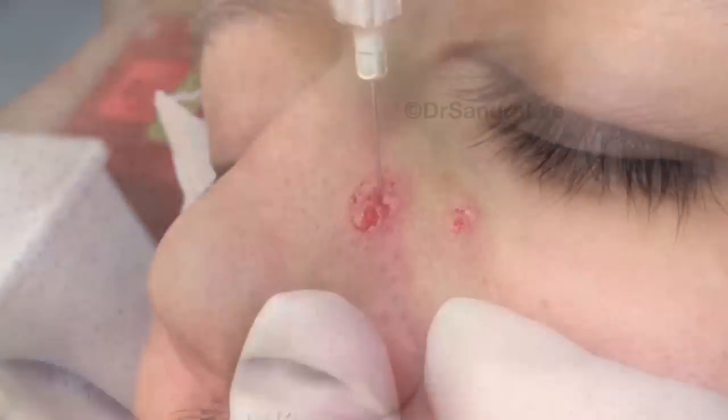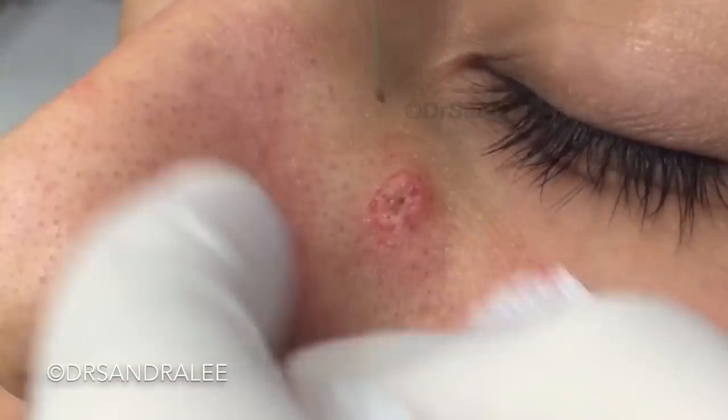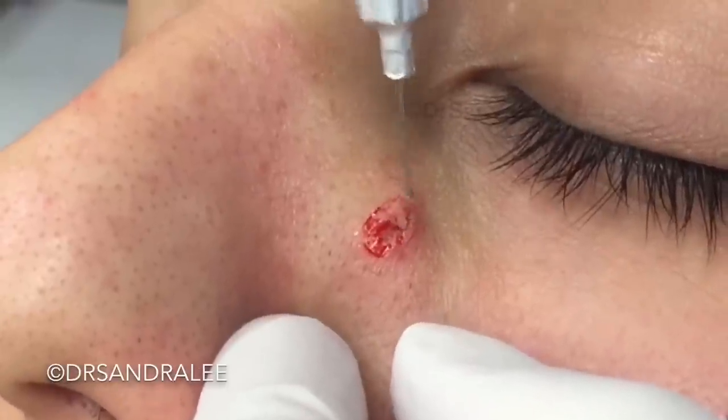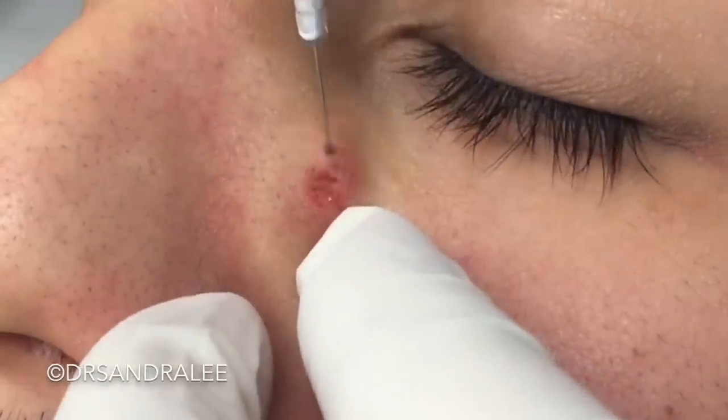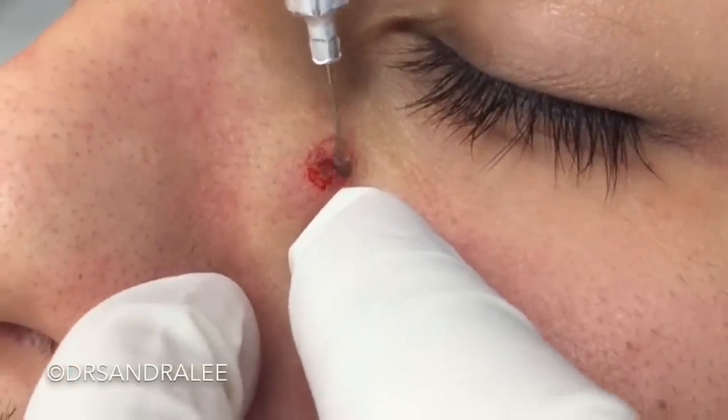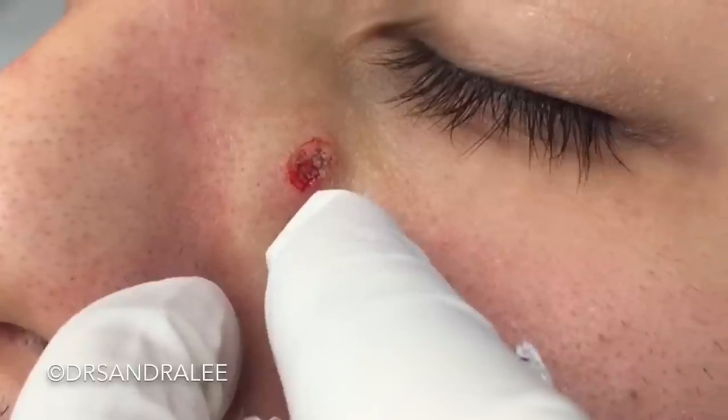There we go. It helps to kind of sculpt the edges a little bit. If I turn it on at a low setting, it kind of helps to get rid of some of the mole cells there too, to make it as flat as we can. So I'm trying to kind of sculpt the edges a little bit.